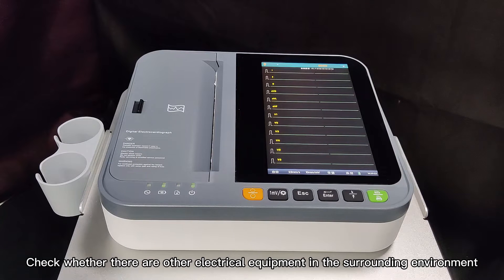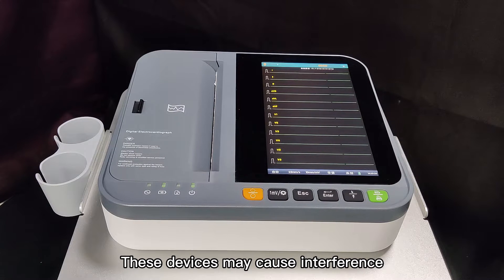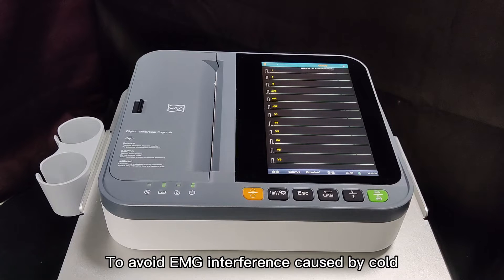Check whether there are other electrical equipment in the surrounding environment, such as electrosurgical equipment, etc. These devices may cause interference. Power off these devices when necessary. Indoor temperature should be no lower than 18 degrees to minimize interference caused by cold.